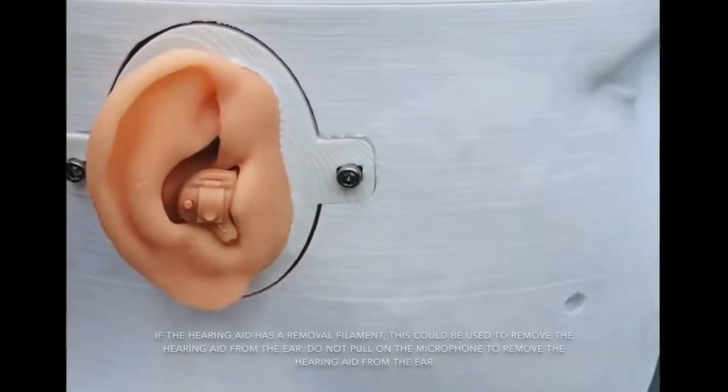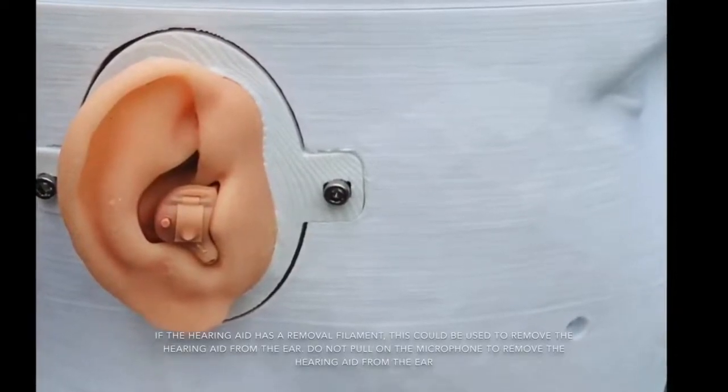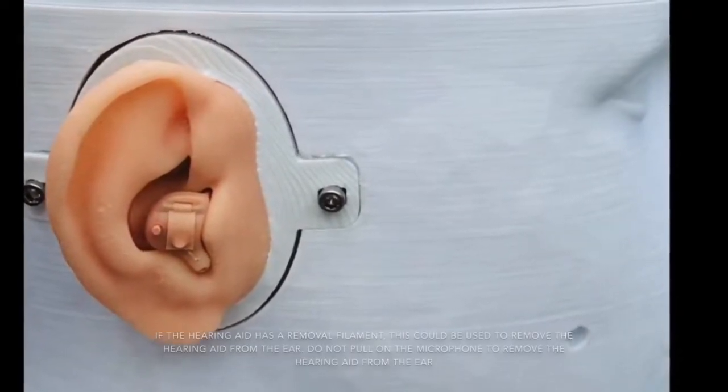If the hearing aid has a removal filament, this could be used to remove the hearing aid from the ear. Do not pull on the microphone to remove the hearing aid from the ear.